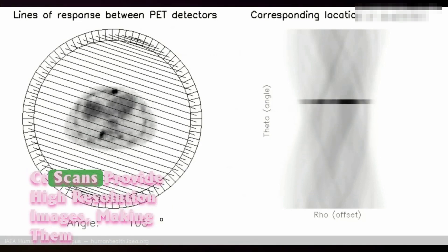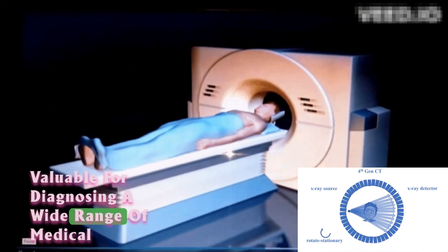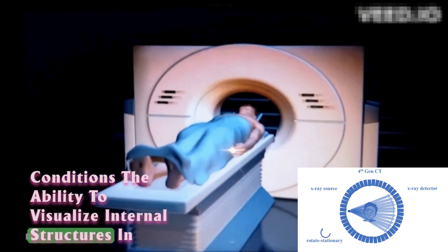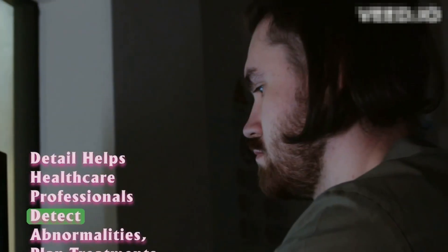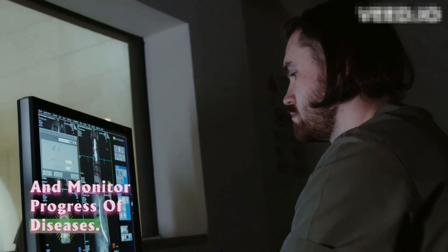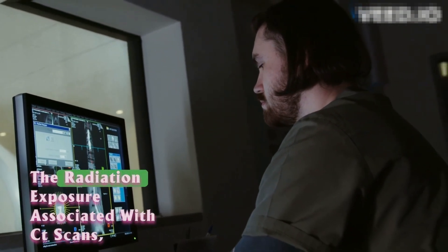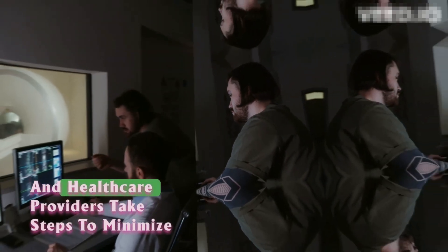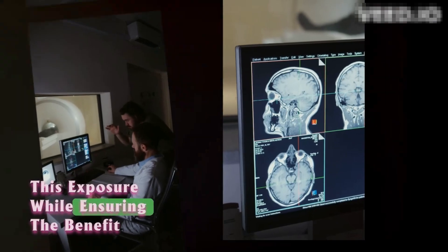CT scans provide high-resolution images, making them valuable for diagnosing a wide range of medical conditions. The ability to visualize internal structures in detail helps healthcare professionals detect abnormalities, plan treatments, and monitor the progress of diseases. However, it's important to be mindful of the radiation exposure associated with CT scans, and healthcare providers take steps to minimize this exposure while ensuring the benefit of the CT scans.